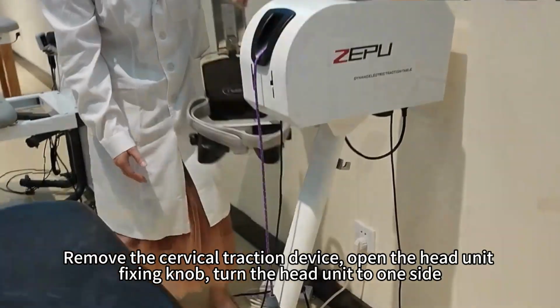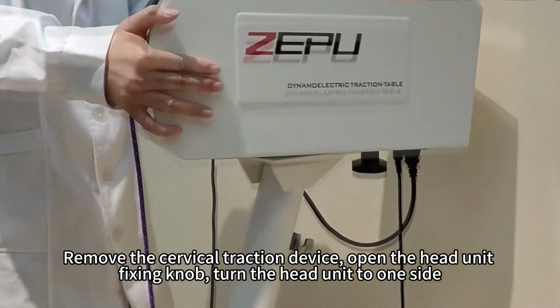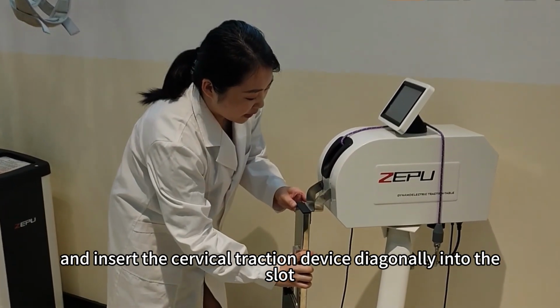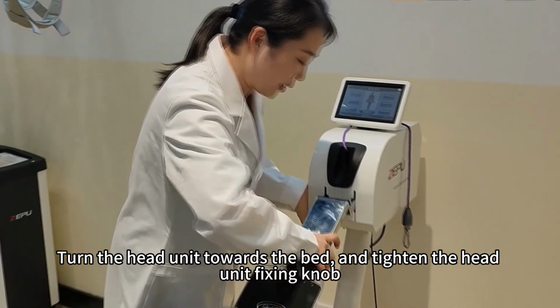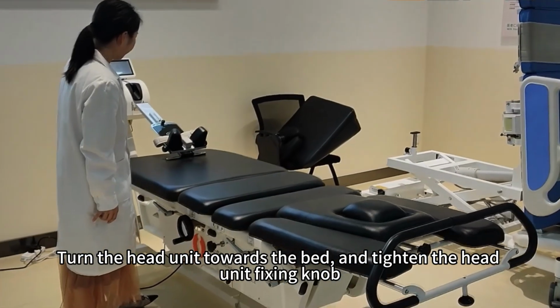Remove the cervical traction device. Open the head unit fixing knob. Turn the head unit to one side and insert the cervical traction device diagonally into the slot. Turn the head unit towards the bed and tighten the head unit fixing knob.